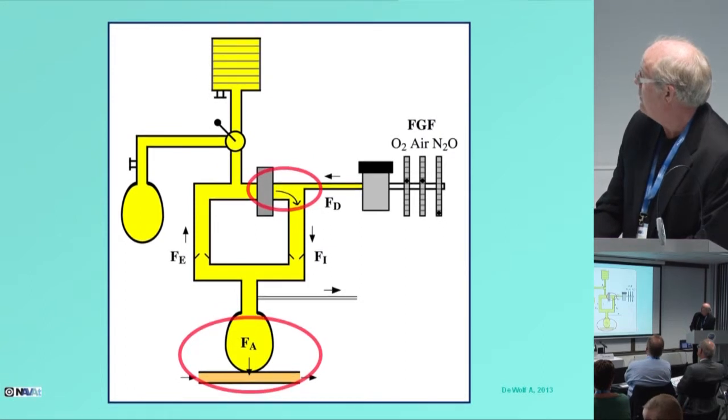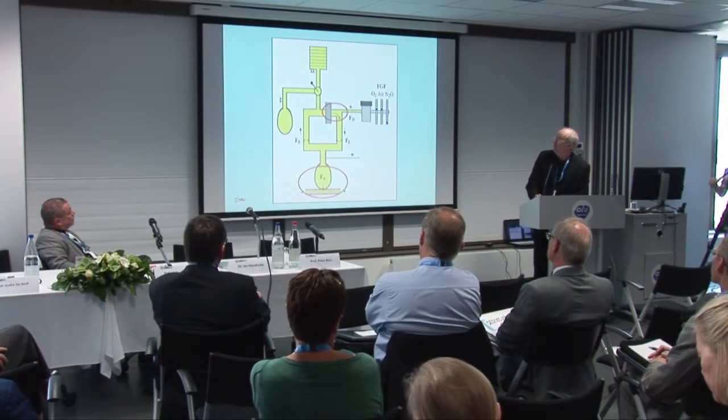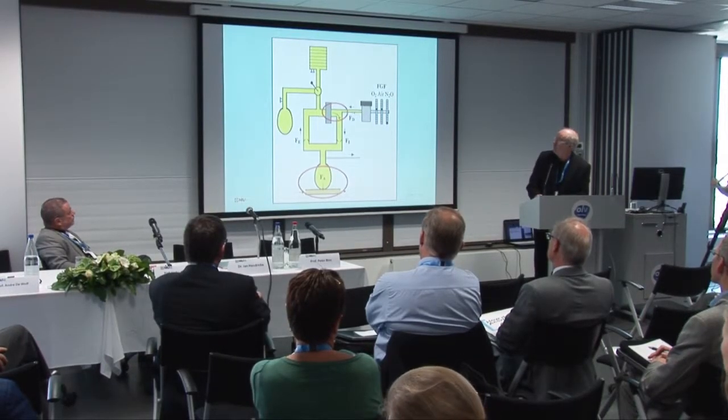when we lower fresh gas flow, we will have more rebreathing. In other words, more of the exhaled gas will be re-inhaled if we lower the fresh gas flow here. So the reason why the delivered concentration is different from the inspired concentration is because of rebreathing. And because the patient takes up agent in the alveoli, there is a difference between alveolar and inspired concentration.